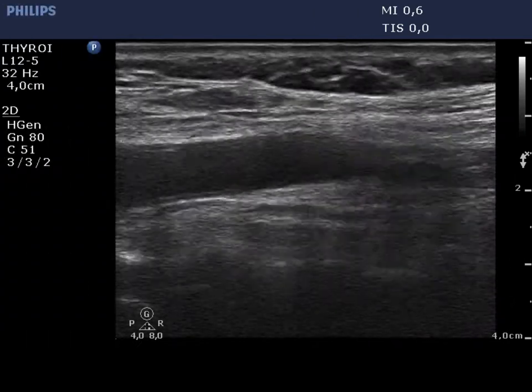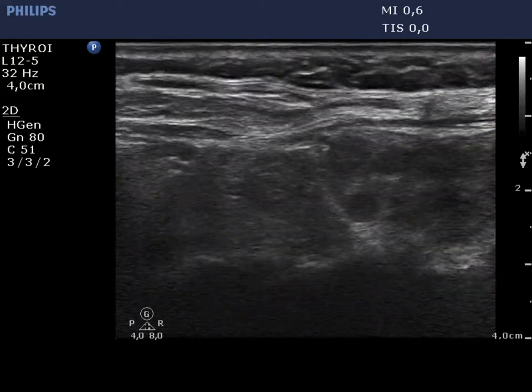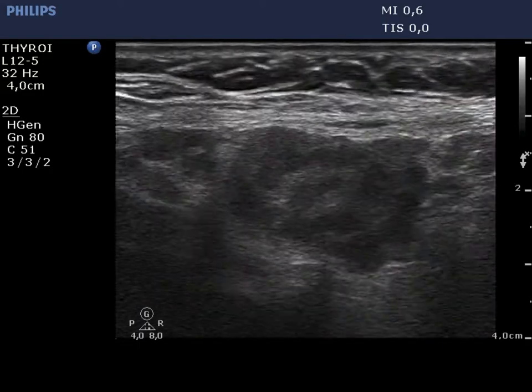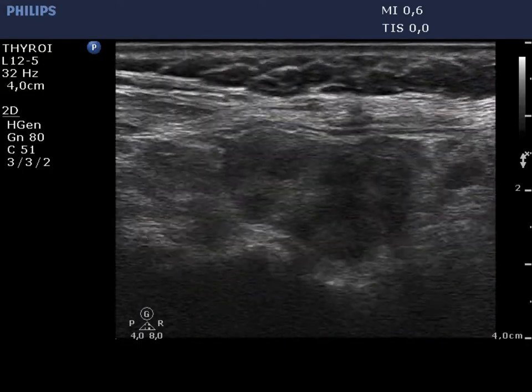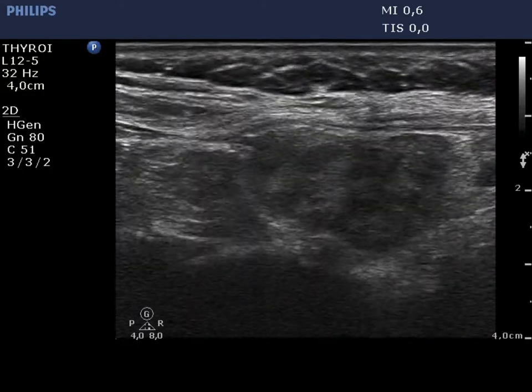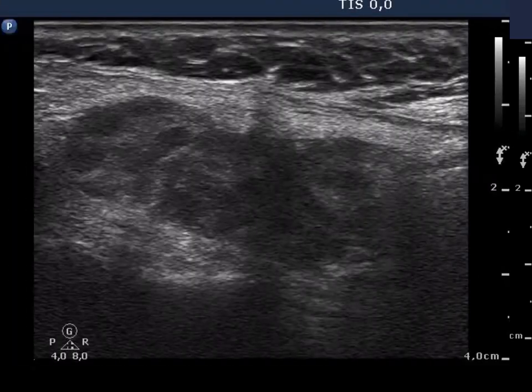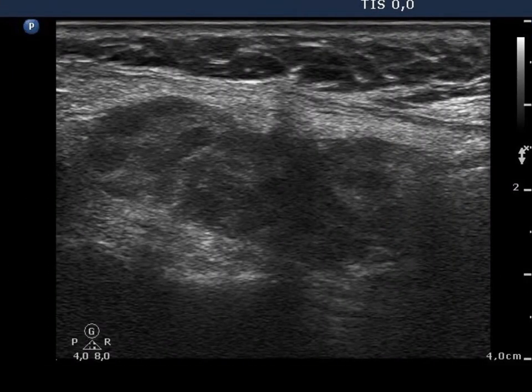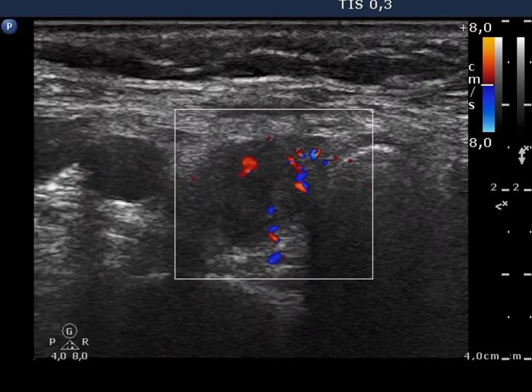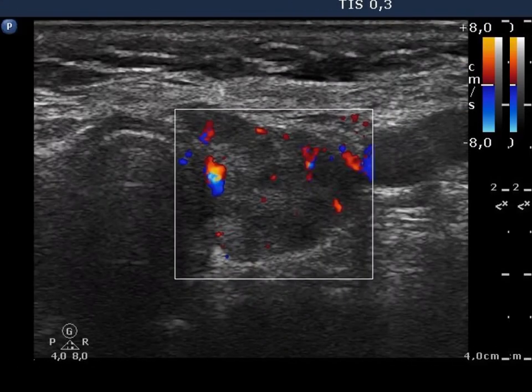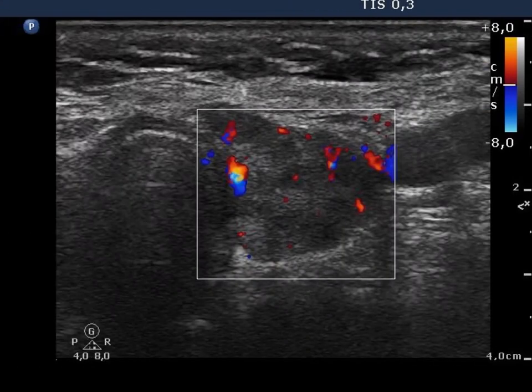The left lobe has a similar echo pattern. It is worth taking note of this very special pattern of an operated thyroid. The vascularization is slightly increased.